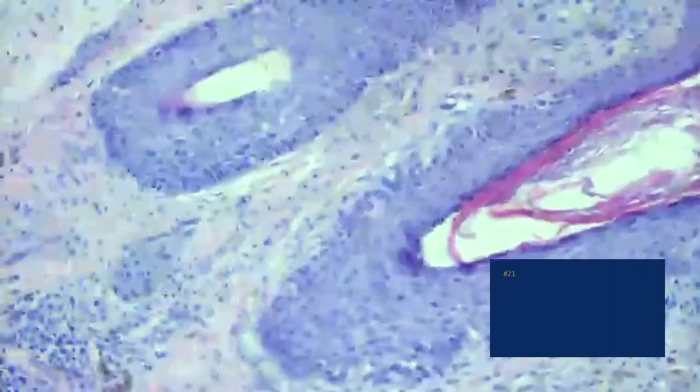Yeah. I was concerned for melanoma. I was looking for other areas that were deeper. I didn't see much. I guess at the lateral portion over there, there were some single cells. Yeah, there are some single cells here going out.